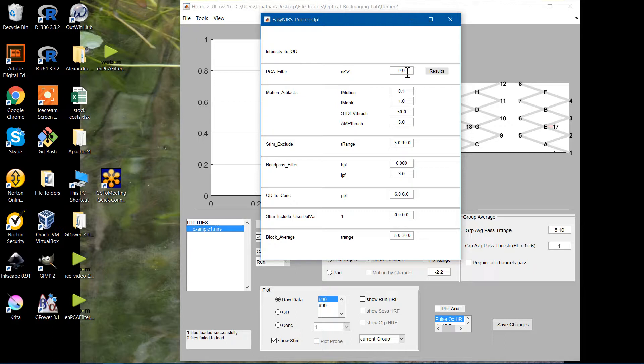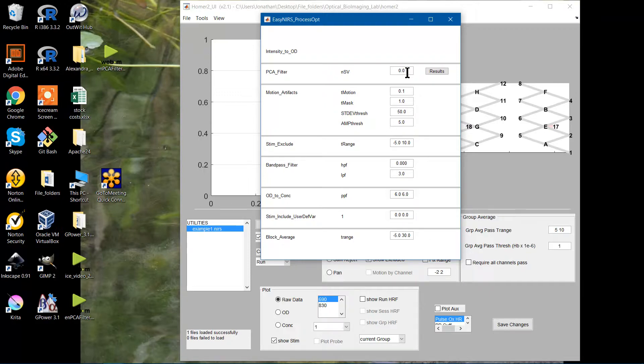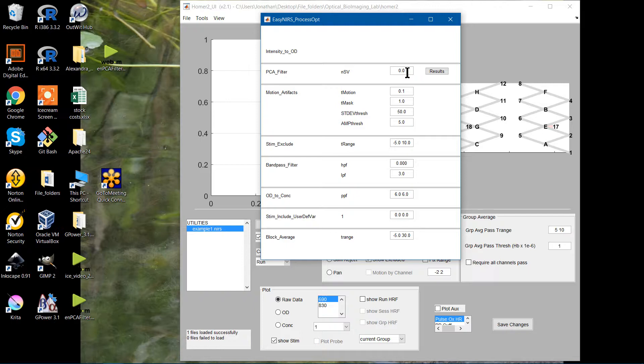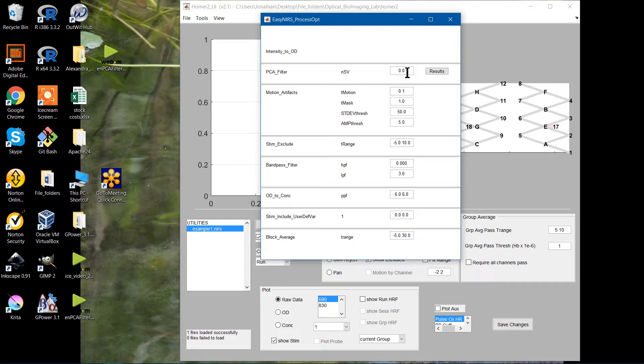If you use a decimal, it's basically asking for a percentage of variation. That is how much variation you are looking to remove from your data. So if you say 10%, I'm looking to remove 10% of variation from my data. It will remove however many components necessary in order to accomplish that goal.